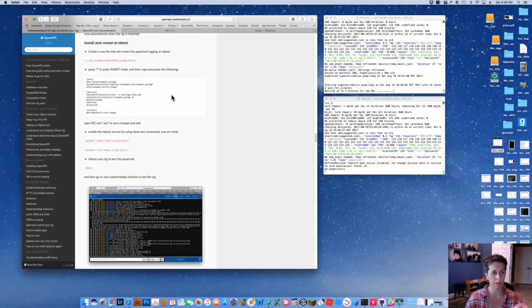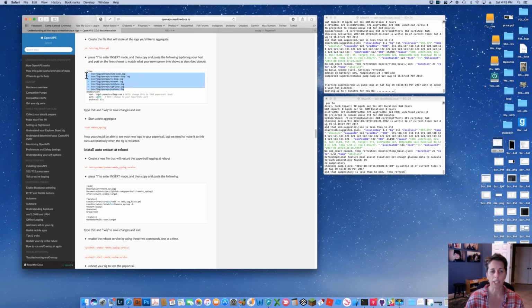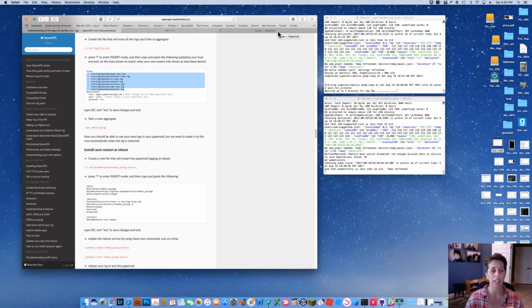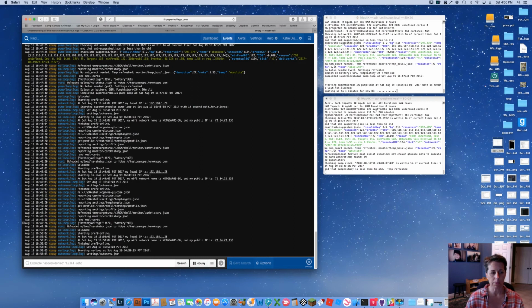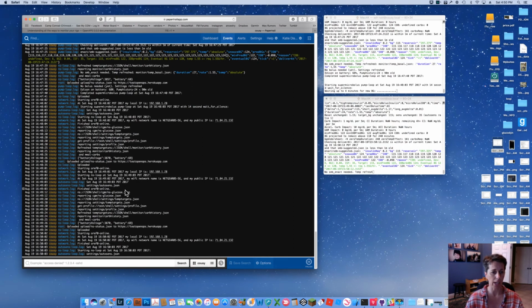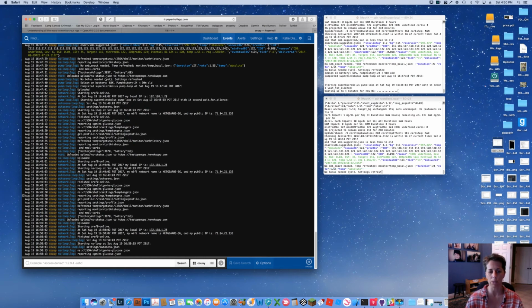So there's a bunch of different logs that are all included in the setup. For example, I'm going to go back up here. All of these logs are being captured and uploaded to your Papertrail account, but they're all being captured and uploaded in chronological order. So the problem is if something's going wrong and you take a screenshot and post online to try and get help, the chances are that most of the screen is filled with less than valuable information.